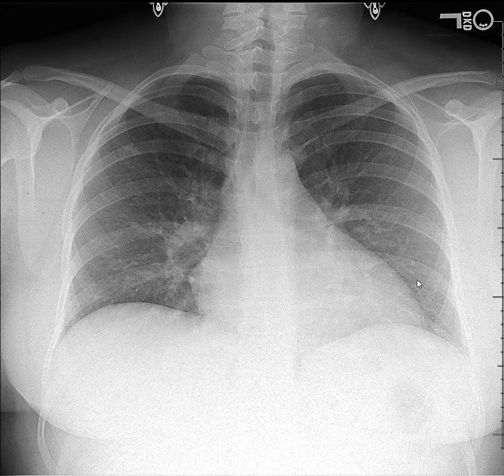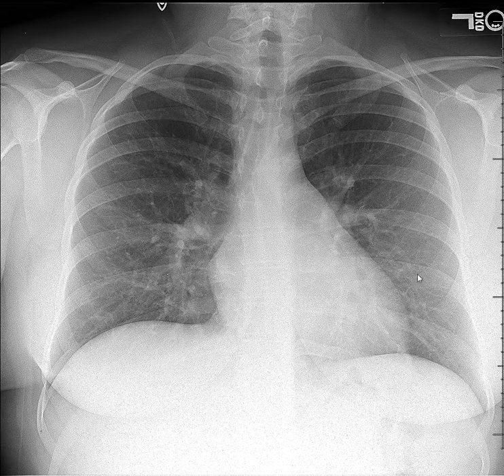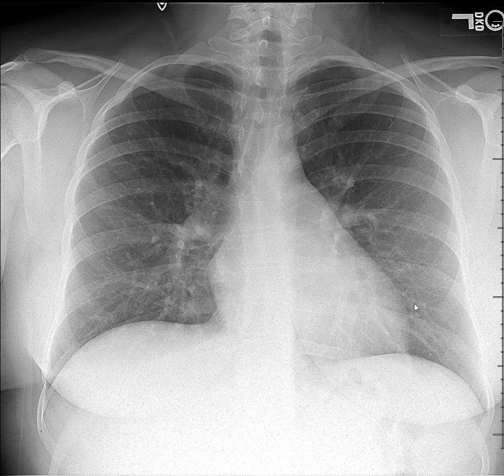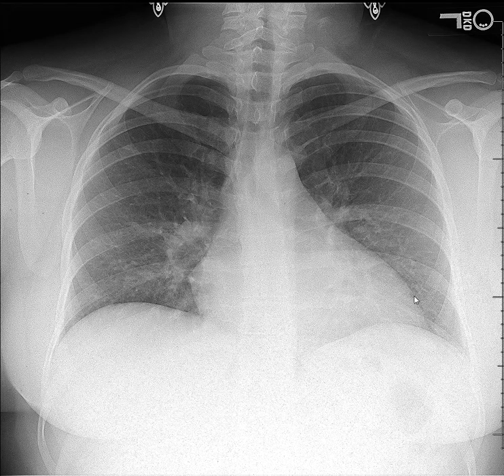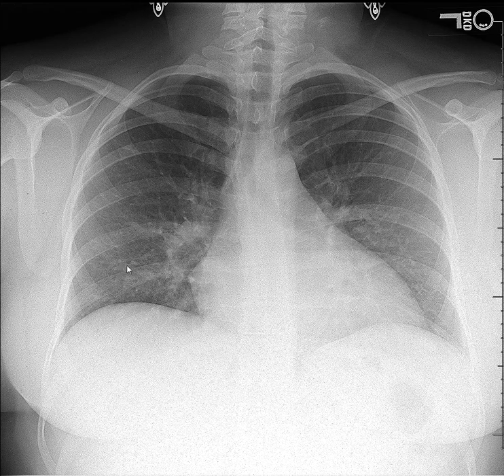On inspiration the lung looks clear, but on expiration you see little webs and a little network pattern due to the crowded lung tissue.